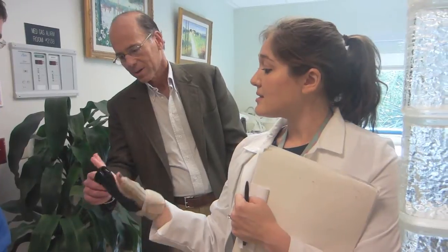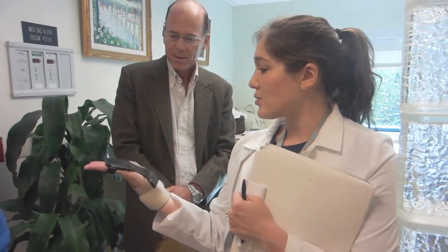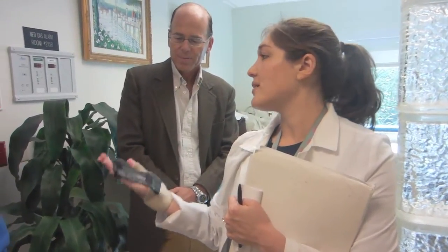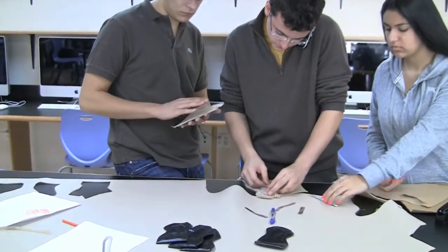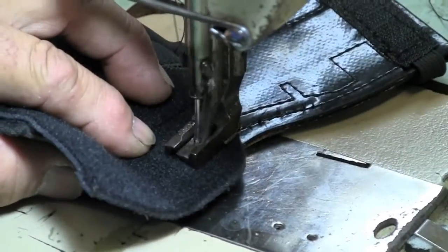What's also nice is that it keeps your fingers together, so when you spread them apart, even though that creates more surface area, it's a lot more stabilizing, because then they can put more weight on the index or on the pinky and create strain there, so that's really nice. We liked the idea of allowing users to insert different splints and stays, so we decided to develop this concept into our final prototype.